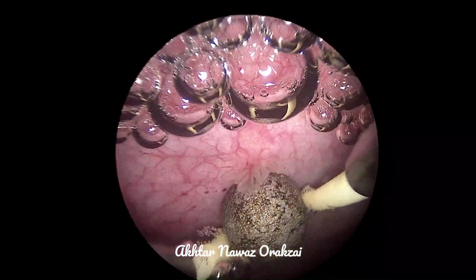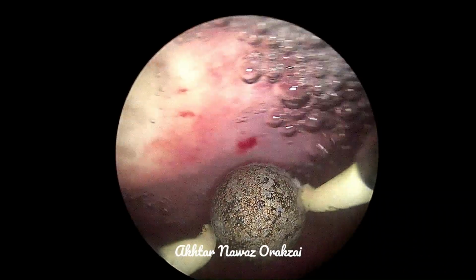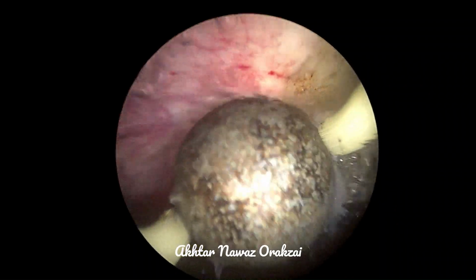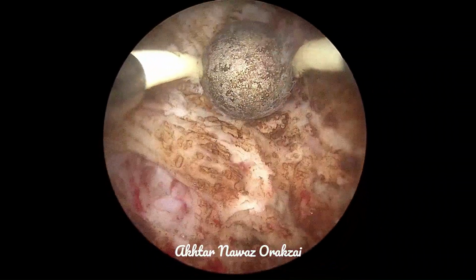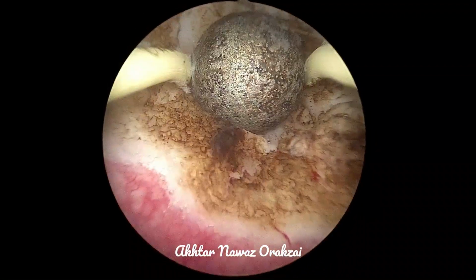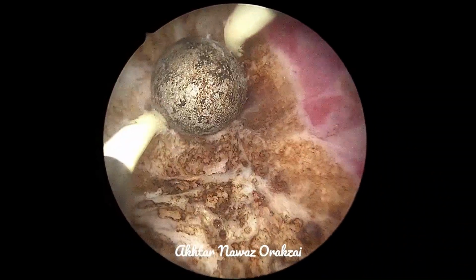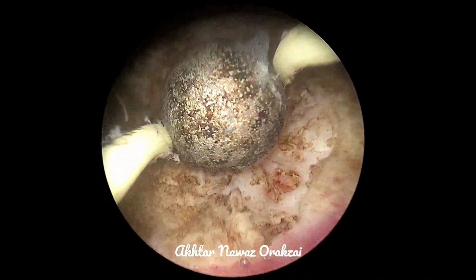So we also coagulate and fulgurate small papillary growths. Surprisingly, these growths were not visible on first cystoscopy. After making the bladder empty quite a few times, these papillary growths have appeared.